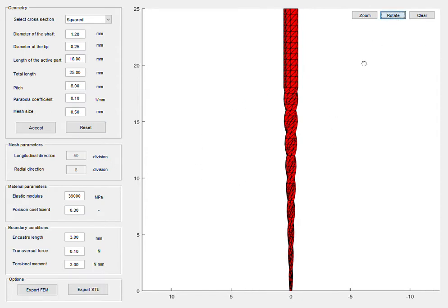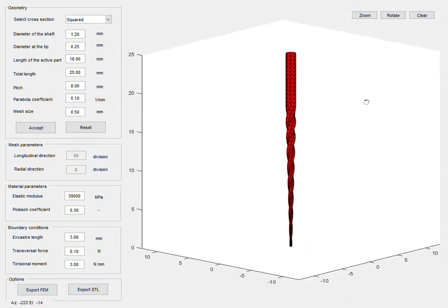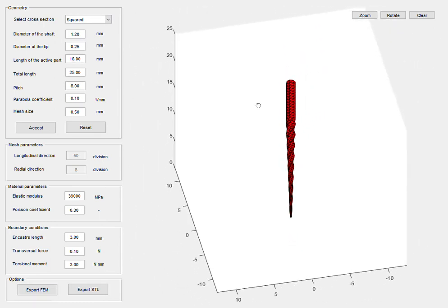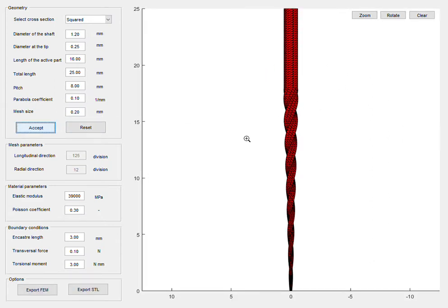We can rotate the model. And as you can see, this is quite a coarse mesh, so we can now specify a finer mesh. And now we can see that the triangles are smaller, so the geometrical features of the endodontic rotary file are more accurate. Of course, we can change any other parameter.